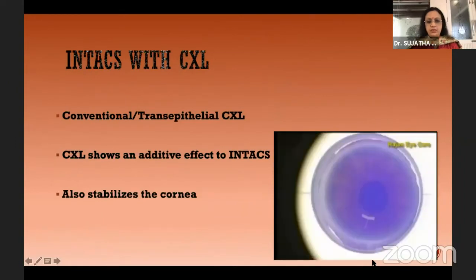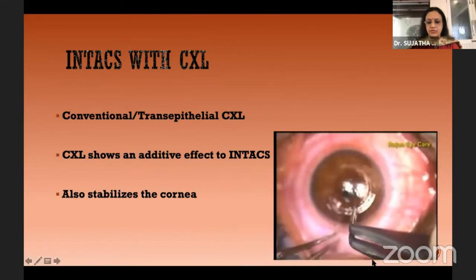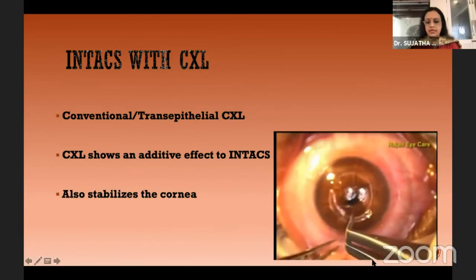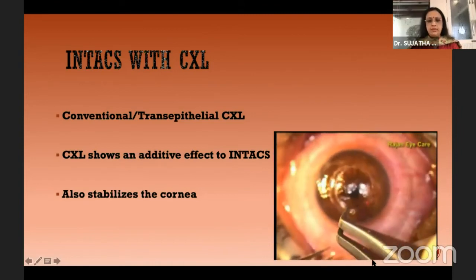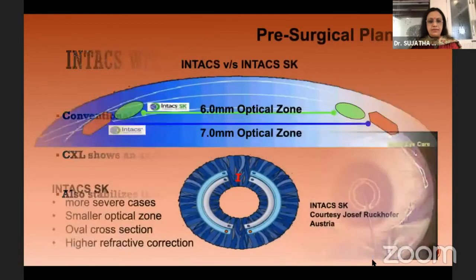So it can be combined with other procedures, such as transepithelial cross-linking. It can show additive effect with cross-linking. It can also be done with Intacs. And thereby not only stabilizing the cornea, but it's also making sure that some amount of refractive effect is attained by the patient.